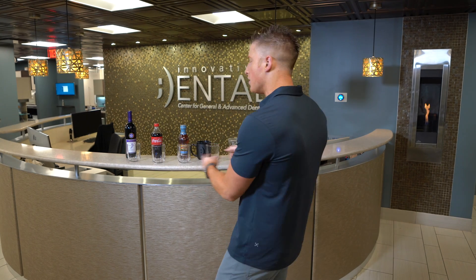First thing we've got to do to run this test is we've got to have some veneers, right? So at Innovative Dental, we're going to go ahead and make veneers — five veneers to go in these five glasses, so we can run the test and find out: do veneers really stain? For our veneer, we're going to be using a material called Emacs. Emacs is a super strong porcelain — it's very aesthetic, looks really pretty, bonds nicely to teeth, and is awesome. It's basically what we use for 99% of our cosmetic treatment here in our office. Let's make some veneers.